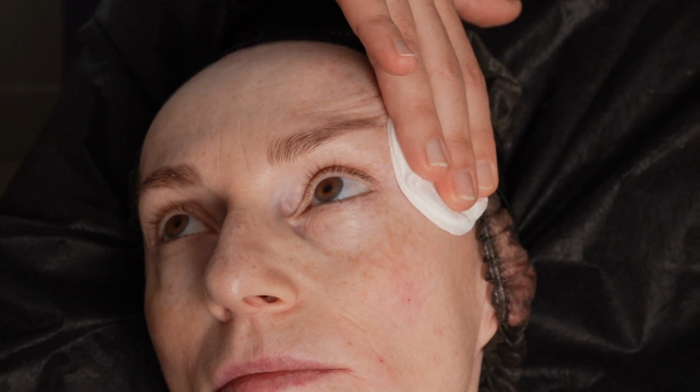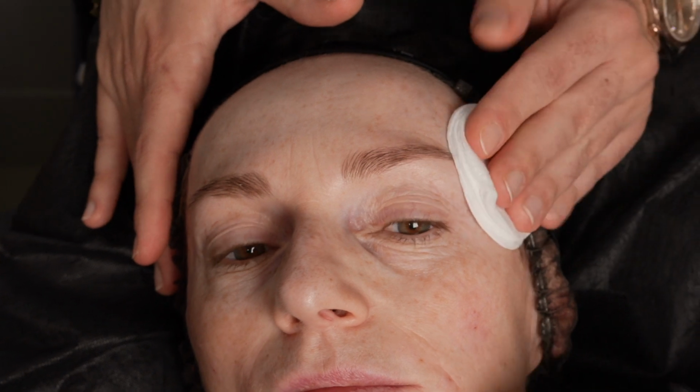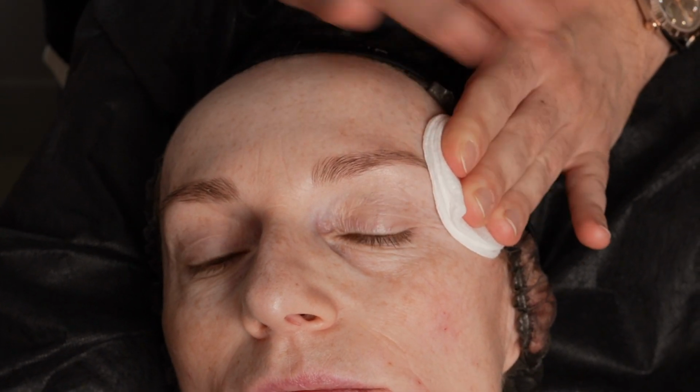Поняла. Да, я поняла. Через 2 недели сделать коррекцию, когда пройдет гематома? Если вдруг. Да. Если что. Окей. Спасибо. Then we wait. Press.